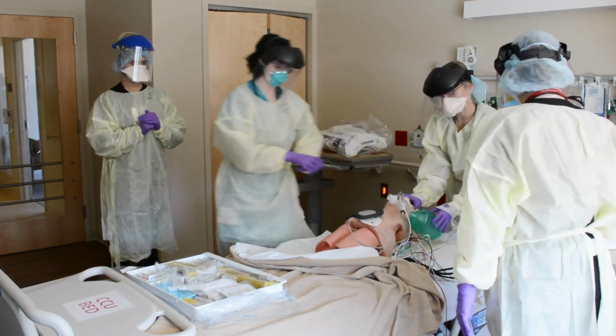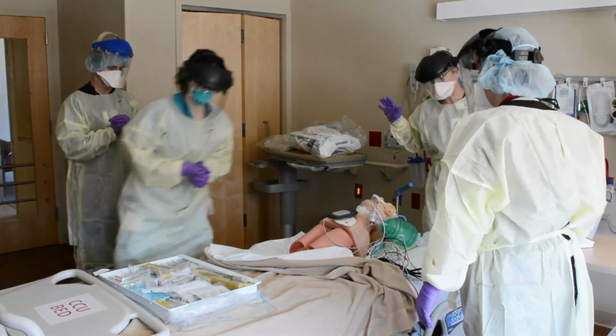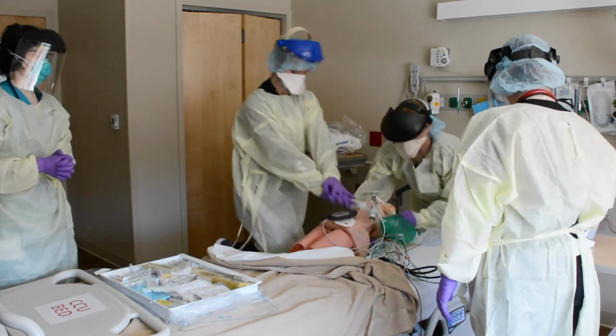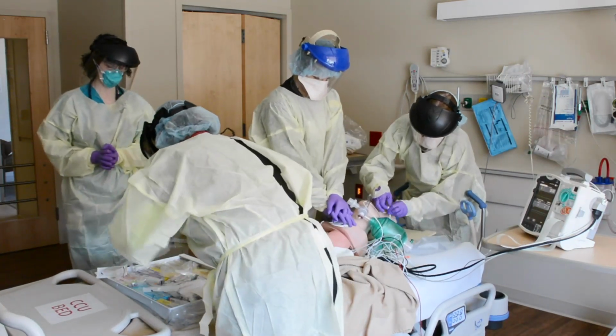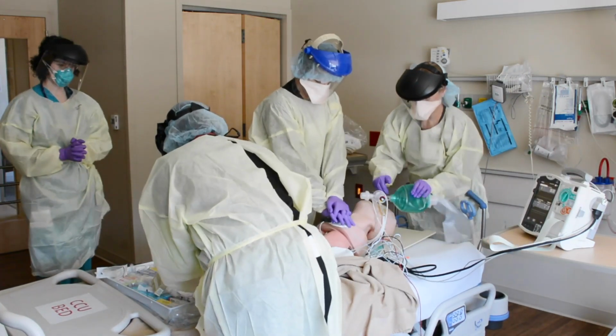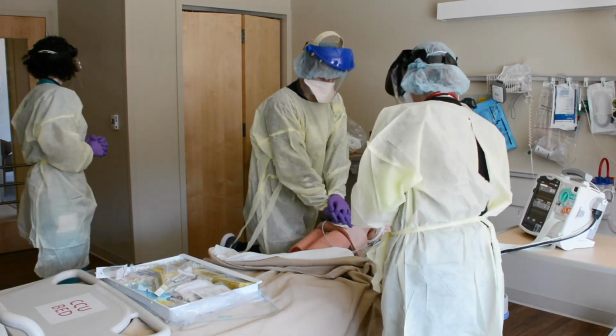Everybody clear the patient? Shocking. Shock delivered, resume compressions. Alright, so if we could drop a milligram of epinephrine, please. Compress faster. Milligram of epinephrine is ready.